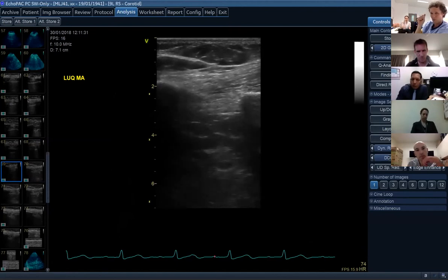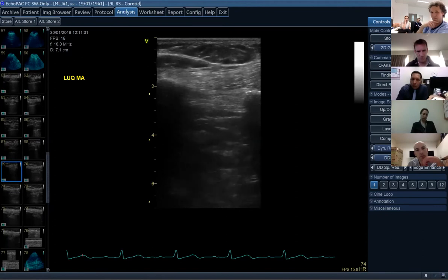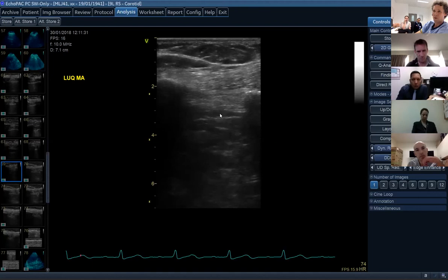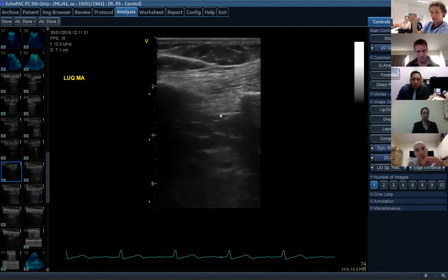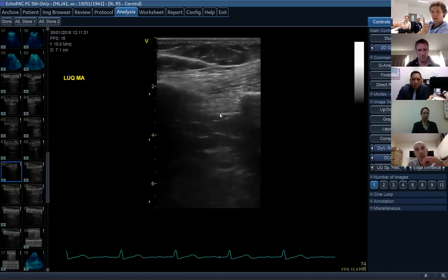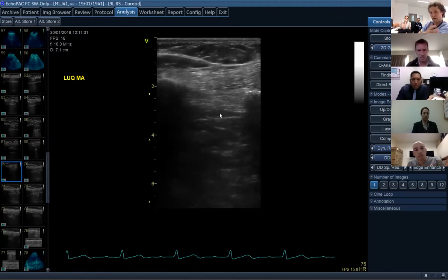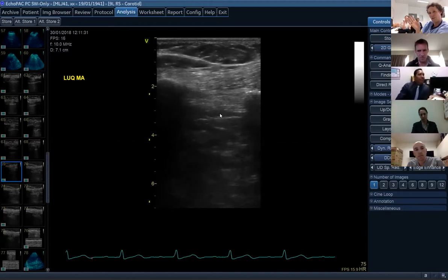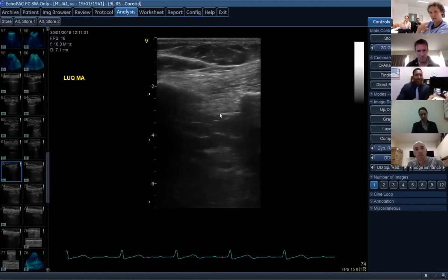And again, these are small sizes we're talking about. But if you can see that when this patient starts to try to breathe in, it doesn't move at all. There's no thickening that goes on in that diaphragm. And this is one of the ways that we can start assessing diaphragm function. And you can compare one side to the other and you see that this side is moving normally. This one is not moving at all.